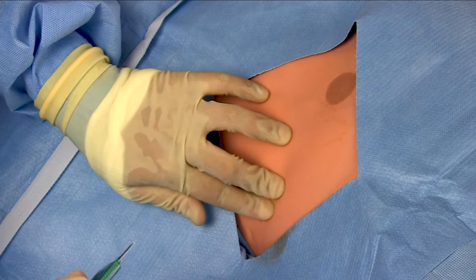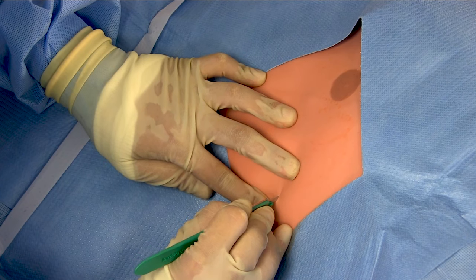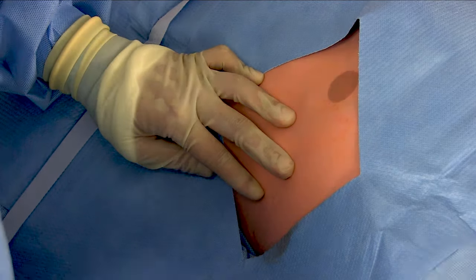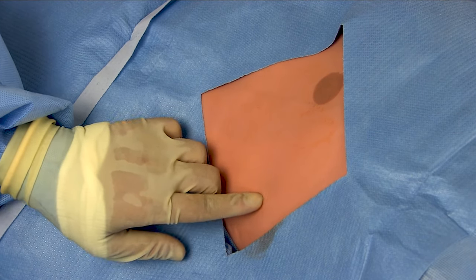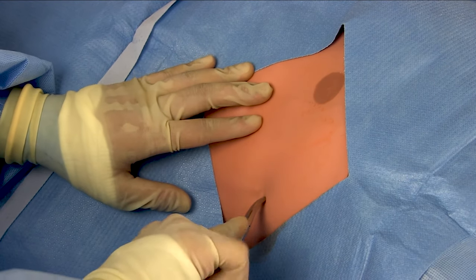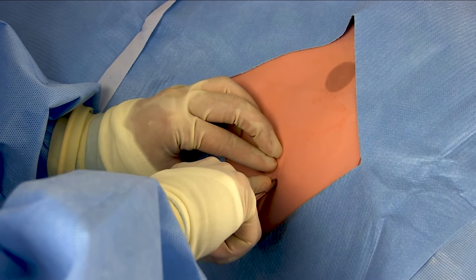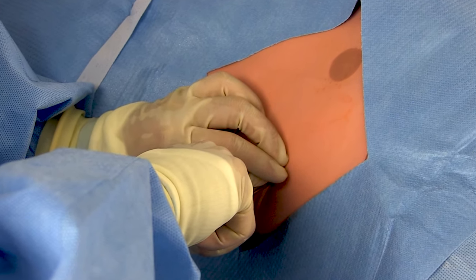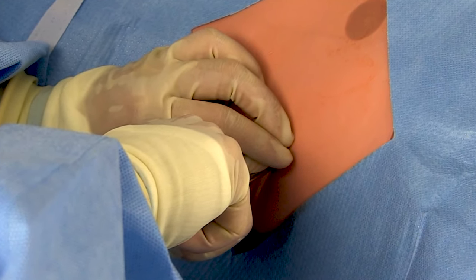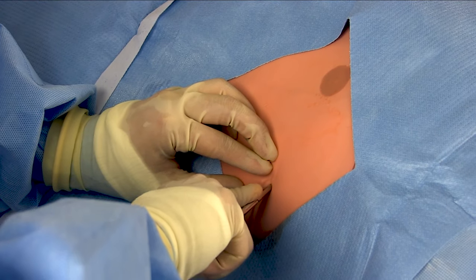Finally, we're ready to cut. Feel again for that intercostal space, make sure your trajectory is going to take you over the rib, then make that incision — it should be two to three centimeters transversely, just over that rib. Now pick up that second pair of Kellys and insert it into the incision. Apply firm but steady pressure down toward the chest wall over that rib until you feel you pop through the parietal pleura. Notice I'm holding the Kellys out high on the neck of the clamp and bracing with my left hand — that helps prevent diving the clamp too deep into the lung.